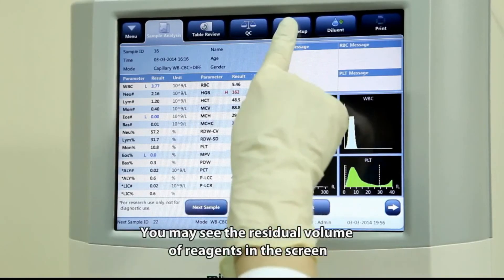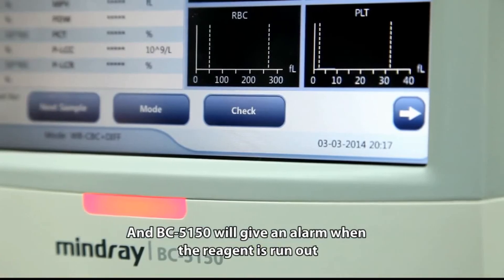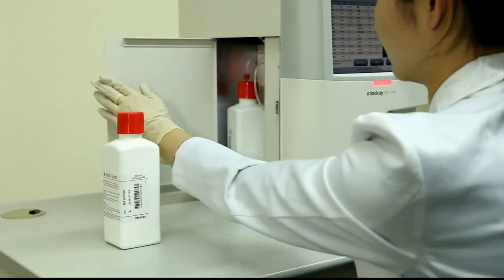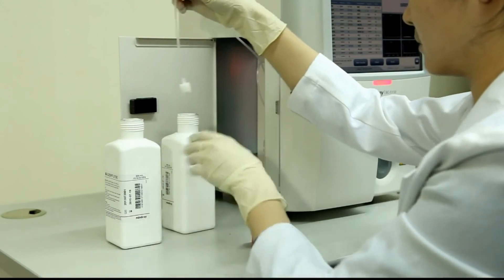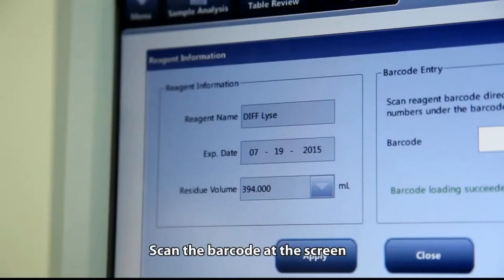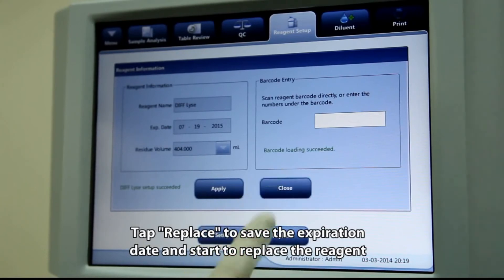You can view the residual volume of reagents on the screen. When a reagent's residual volume is near its end, it will be highlighted in red and BC5150 will give an alarm when the reagent runs out. Tap the reagent you want to replace and then tap Setup. Scan the barcode at the screen; if the barcode is invalid, enter the digits manually. Tap Replace to save the expiration date and begin replacing the reagent.